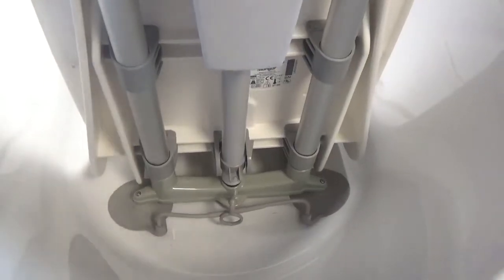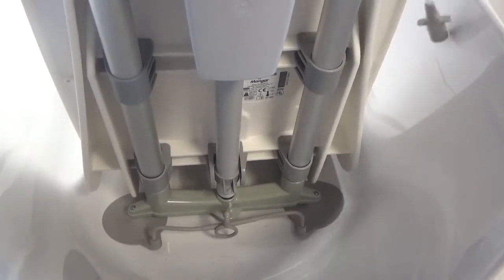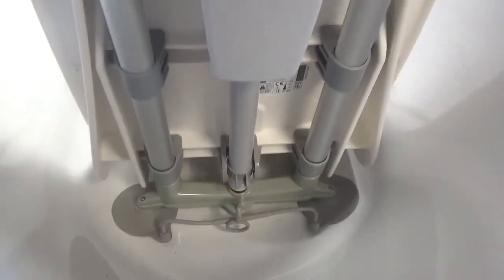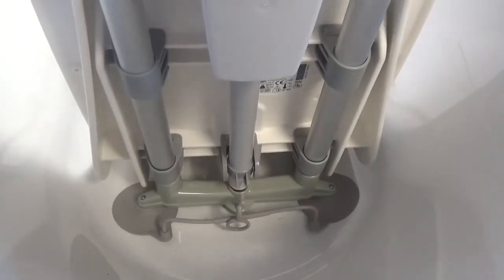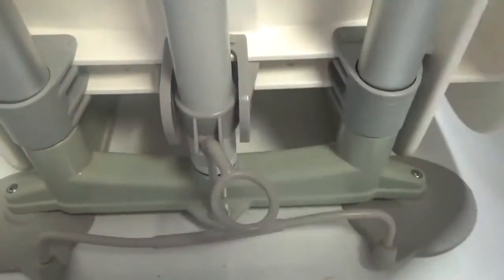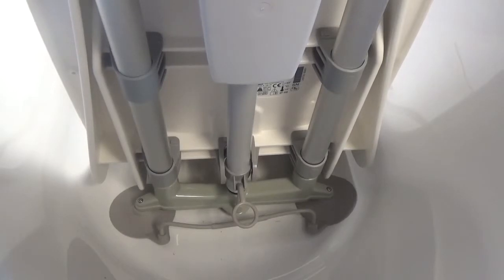Let's look at actually lifting the bath lift out of the bath in one piece. At the moment, if I try and lift, I've actually got 2 actions. However, with this clever little tab here, which I can place over this hook, I lock the bath lift as one solid unit. I now can lift the bath lift out, but please don't fight against the suckers.